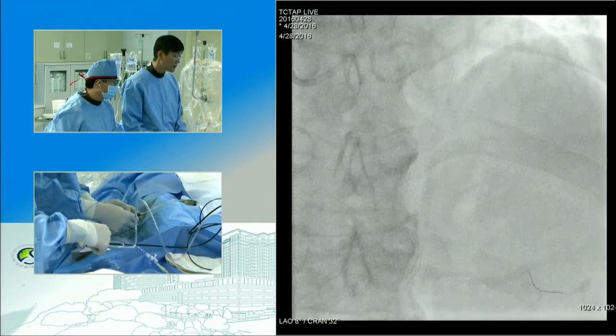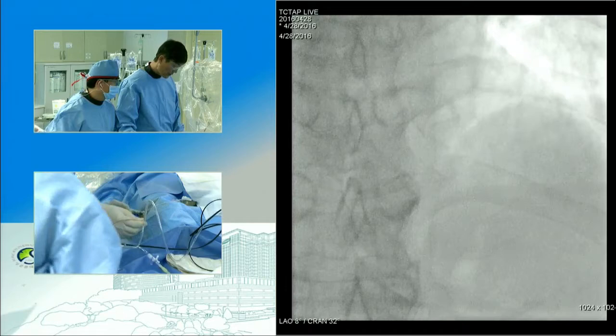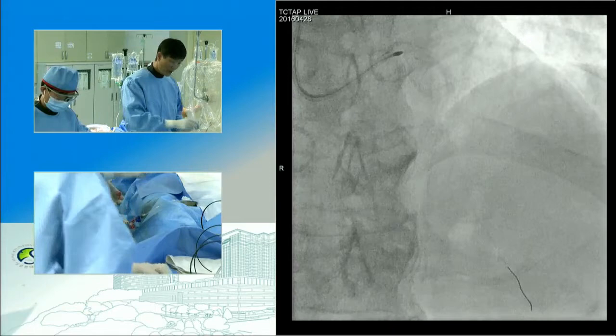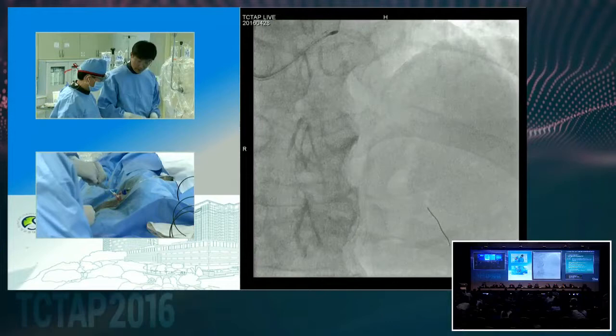Micro catheter. Recently I'm running a rotablation learning center, and I found that many operators don't use the Dynaglide when they insert the rotaburr into the coronary, into the platform. Actually, it is very convenient. You will never lose the guiding catheter or the wire when you use the Dynaglide to insert the rotaburr. We don't have any database. It's experience based.